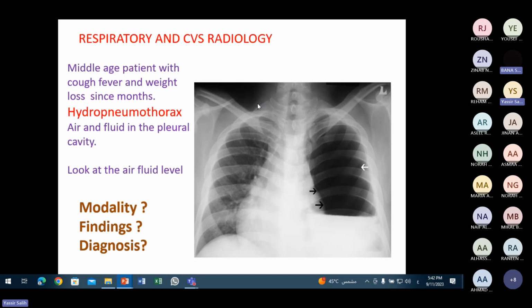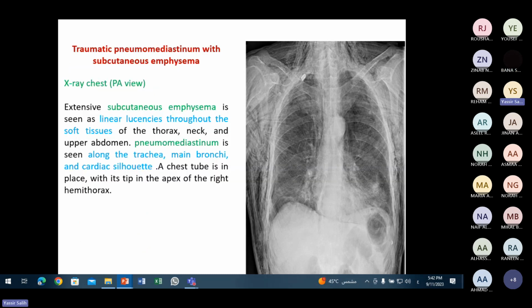The muscle. Gray. Yes. Compare this with this one. Is it grayish? And this one, is it still grayish? It's air under the skin. Yes, hyperlucent. There is a streaky lucency in the subcutaneous tissue.